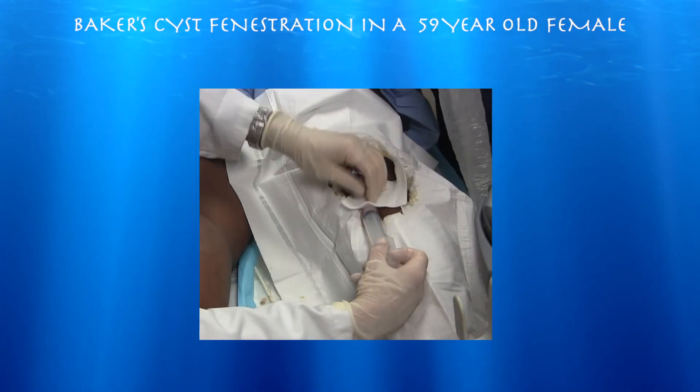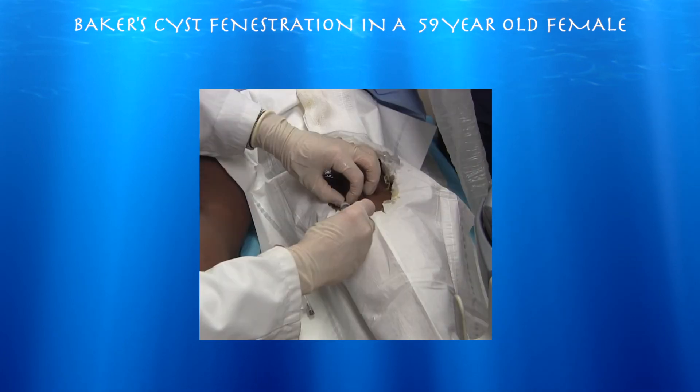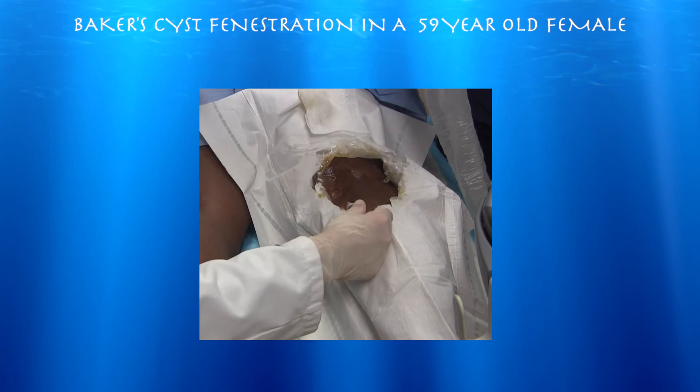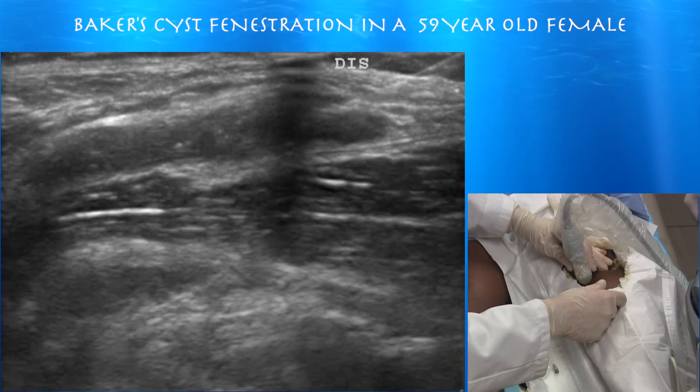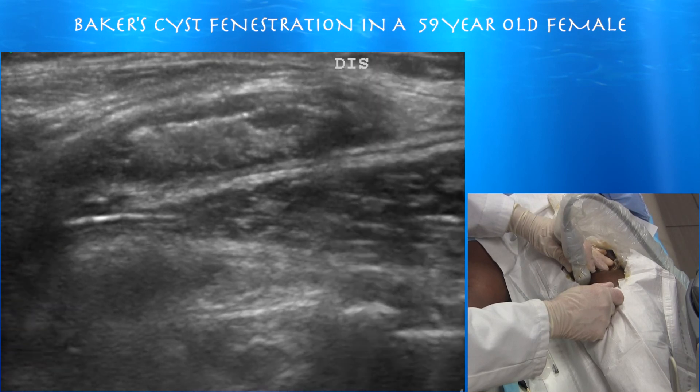We'll inject this with a little bit of cortisone — not as much as the knee — and then we should be done with the procedure. Here's our cortisone injection — that's the cortisone with some saline.